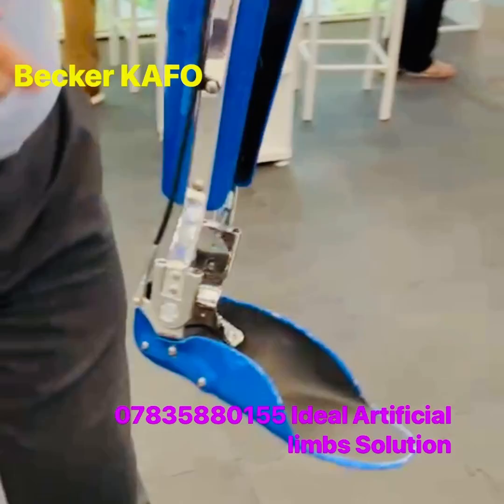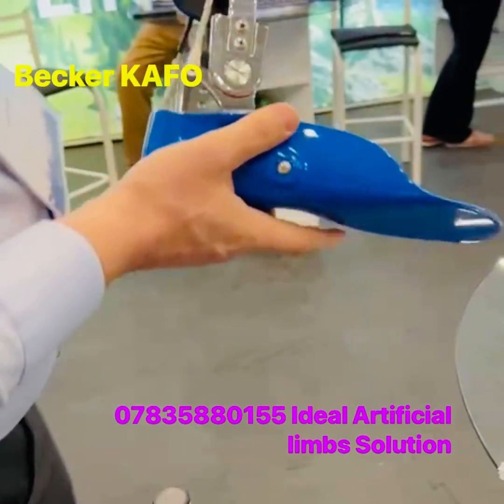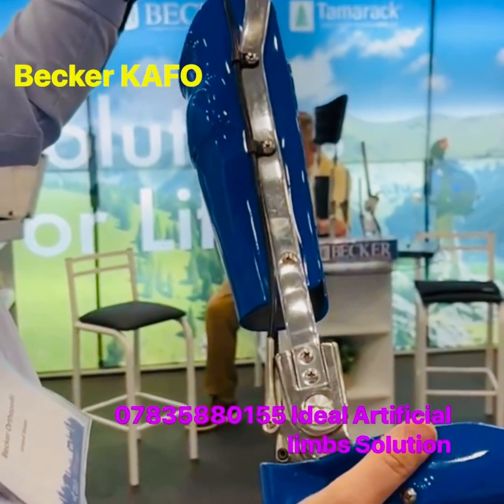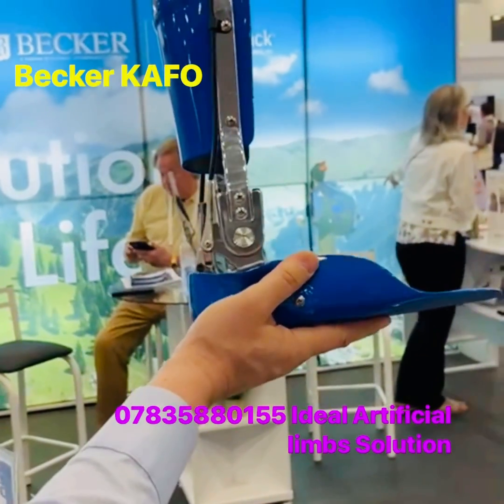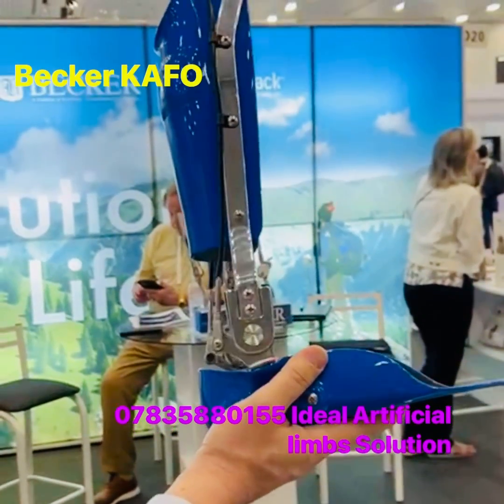If we want to lock the knee, how can we lock it? The knee is locked when it reaches the stretch — in extension. Yeah, extension should be 180. And the tightness of the cable determines at which moment you get the release of the knee.